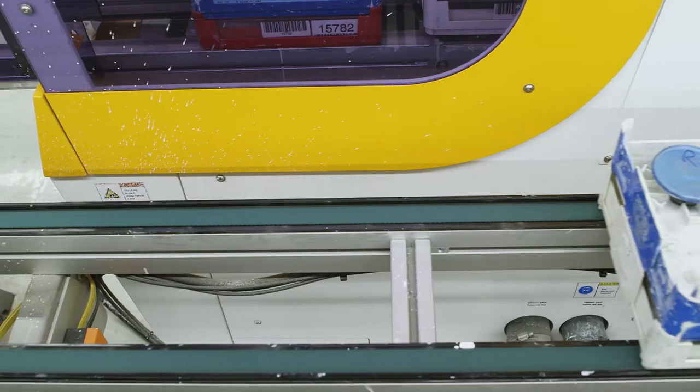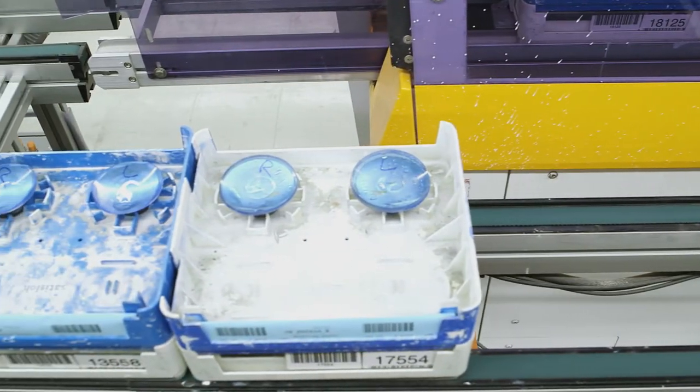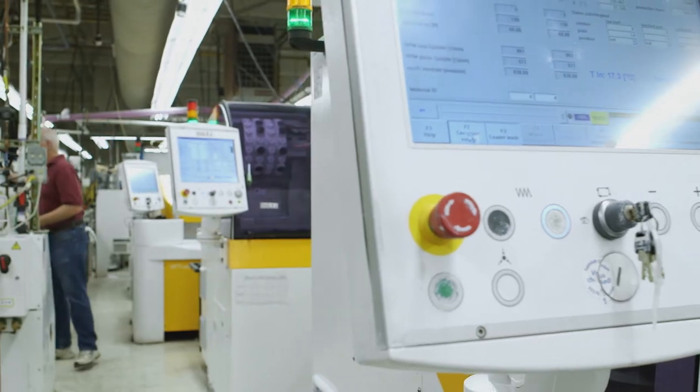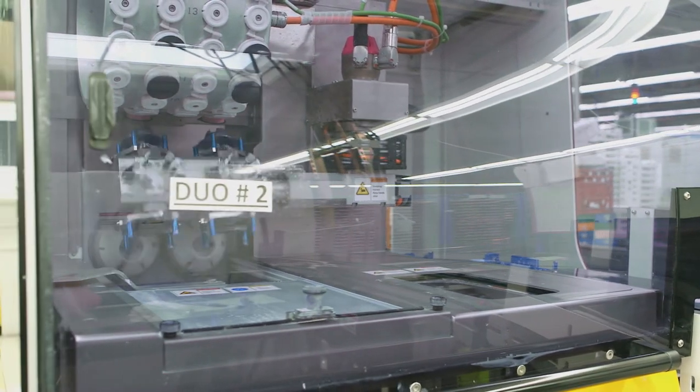After your prescription has been generated into the lens blank, the surface is left rough and has a frosted appearance. The Duoflex polisher returns each lens to pristine condition. Using cutting-edge robotic technology, the Duoflex chooses a unique polishing pad for each lens.